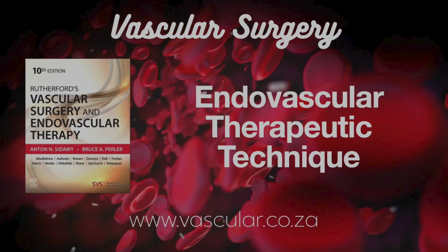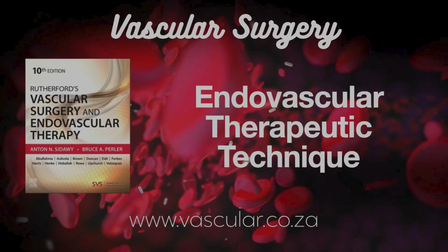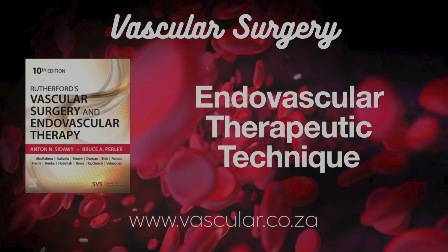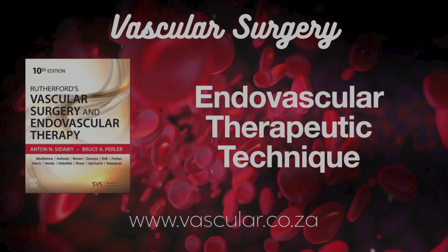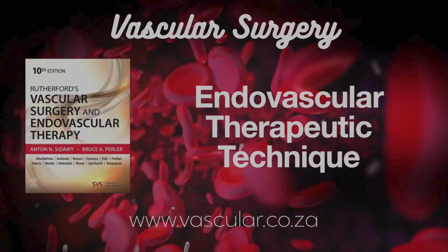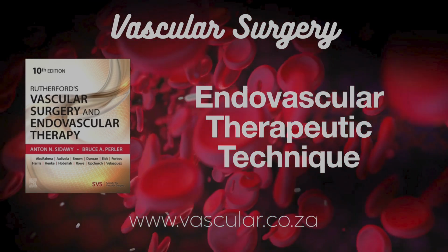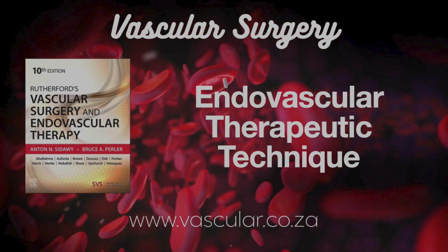And do they work better than regular balloons in those cases? Is there evidence? Some studies suggest advantages, yes. There's evidence for better patency rates compared to conventional PTA for short blockages in the SFA and popliteal arteries. They've also shown use in hemodialysis fistulas, and interestingly, helping to fracture calcium when used with rotational atherectomy.